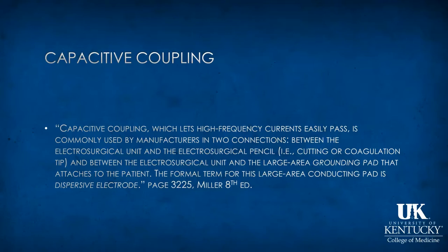And it is the principle for the use of the grounding pad, which is more correctly termed the dispersive electrode, in electrosurgical units and connections to patients.